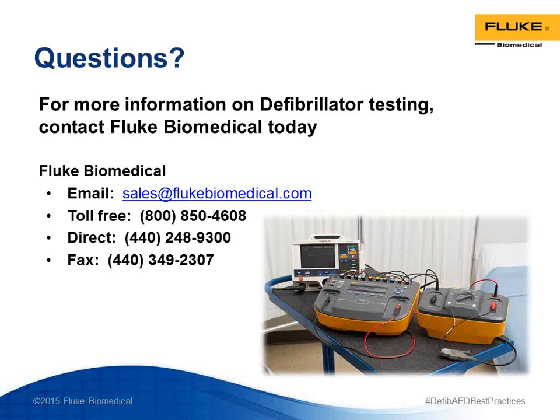Great. Another question for you. Do you recommend discharging an AED when conducting the annual inspection? Yes. However, some AED batteries are not rechargeable after they've been used, so you have to be careful. Our recommendation, and in fact the recommendation of the community of biomedical engineers that we have sampled, is that the biomed department should get a spare or two of the AED batteries for each make and model of AED that they have in the inventory, and use those when doing the testing. I know it seems like that doesn't do an actual righteous test on that AED the way it sits and waits for its next use. However, it does preserve the AED battery for clinical use and nothing else.